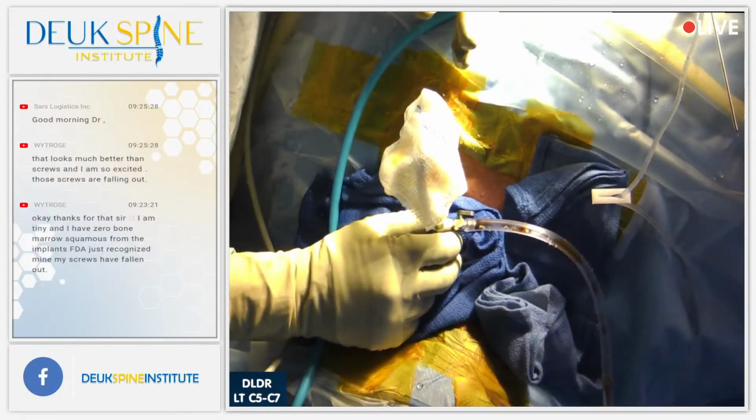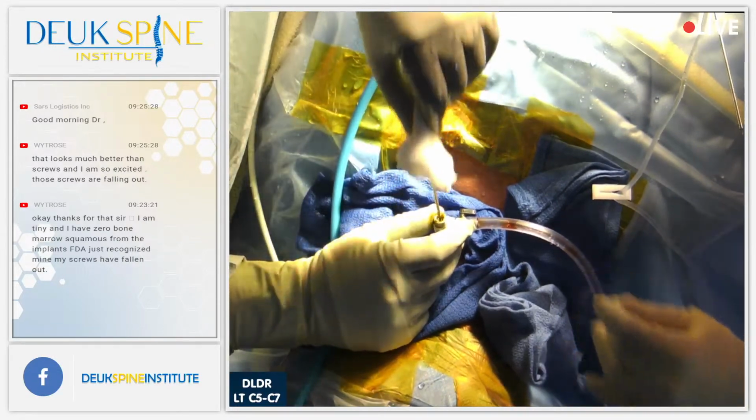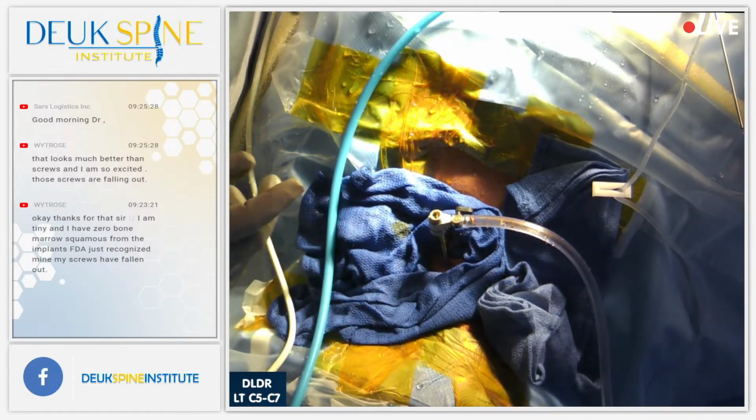My suction's not working here. Come on, we've got to have suction working, guys. All right, let me have some irrigation.